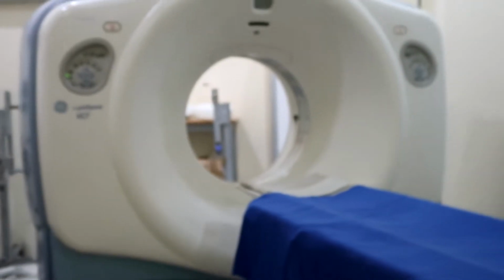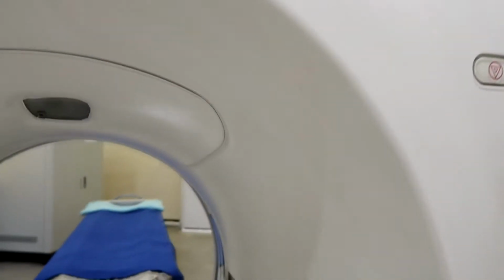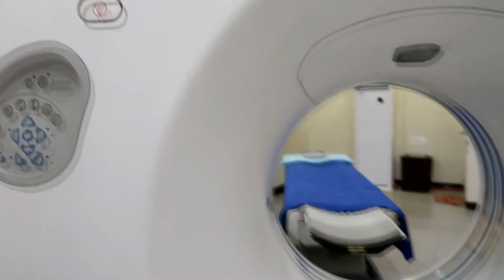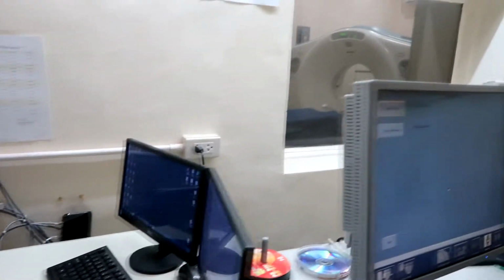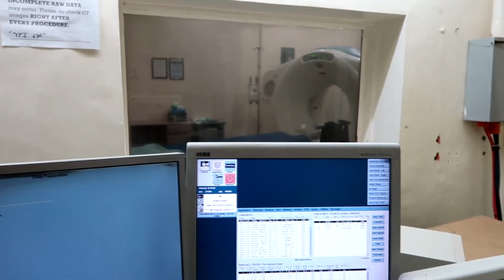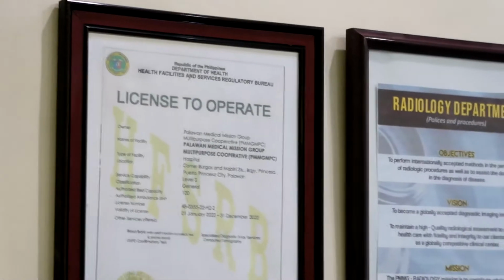For intravenous contrast studies, the radiographer will ask for the result of creatinine. Normally, your kidneys filter creatinine from your blood and send it out of the body in your urine. If there is a problem with your kidneys, creatinine can build up in the blood and less will be released in urine. Inform the patient for at least 3 to 4 hours NPO or nothing per orem. NPO is usually prescribed as a safety precaution. Without it, you can become nauseous once contrast or sedation is administered because you have something in your stomach that can lead to aspiration.